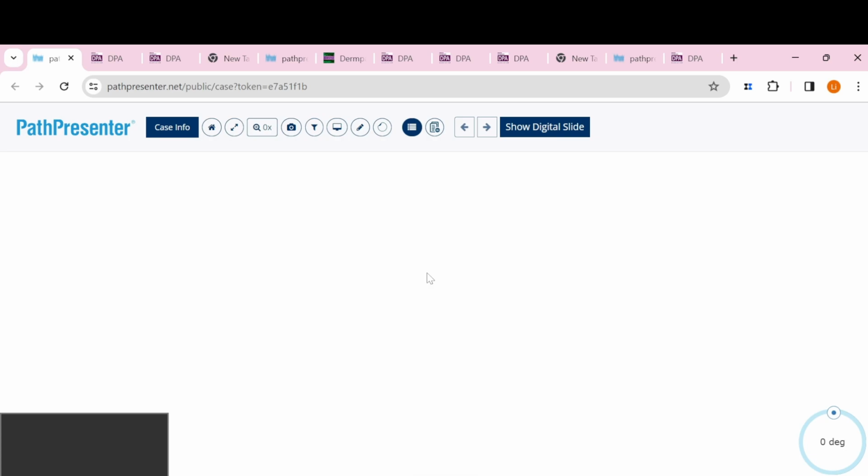Because I opened the slide ahead, so maybe it will take time for it to reload the slide.